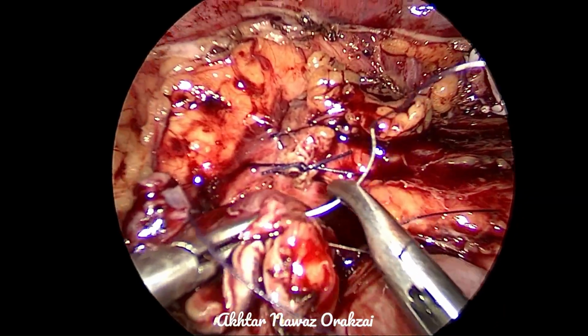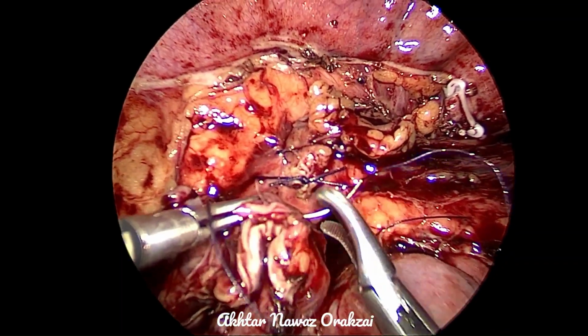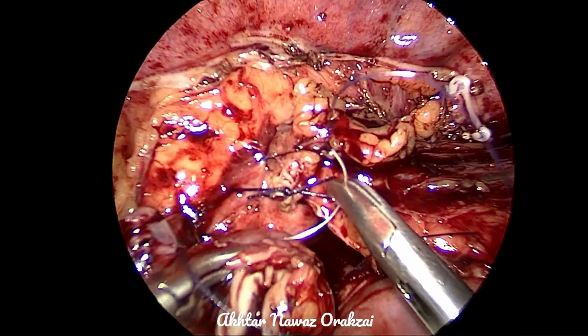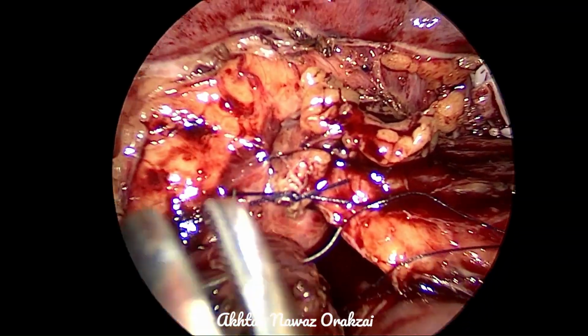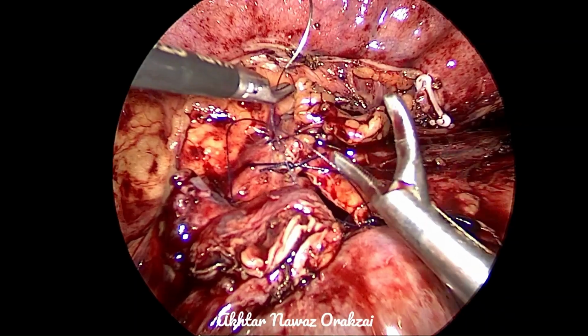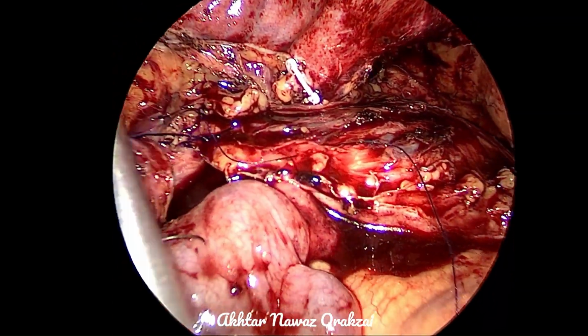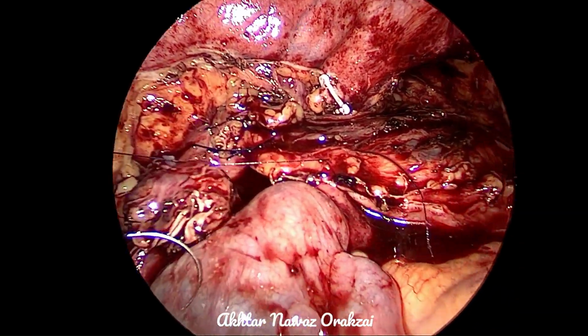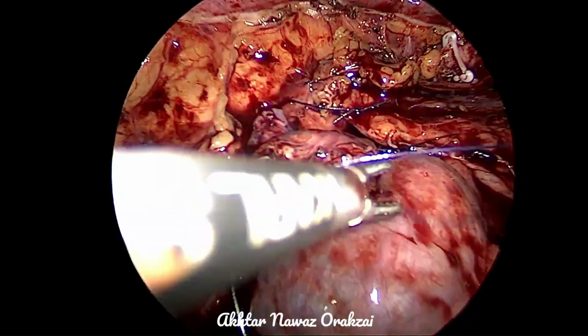It is important to mention here that this stitch must not be deep, only a serosal layer. It should not be transluminal, because you may catch the other wall of the ureter, and this will lead to obstruction again.